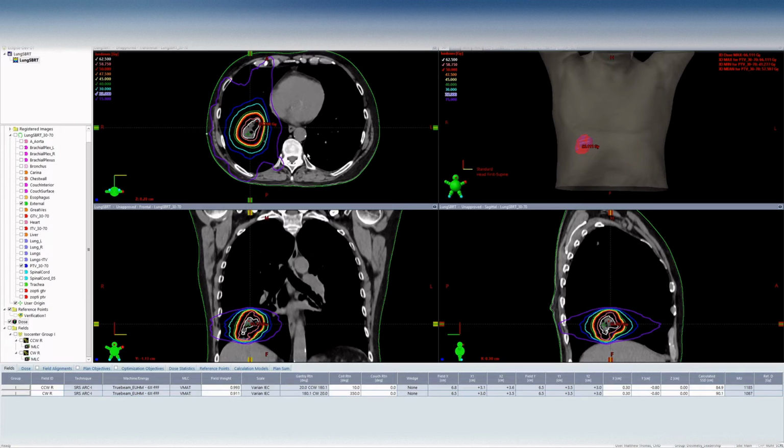Okay, so the things that we want to measure, we call them conformity indices or indexes, and we use a couple. Each treatment center might use different conformity indexes, but some common ones are the CI, or conformity index, which the simple one is defined as the volume of the 100% divided by the PTV volume. And then another common one is called the R50. The CI that I described, you could call it the R100. And then the R50 is simply the volume of the 50% isodose line divided by the PTV volume.